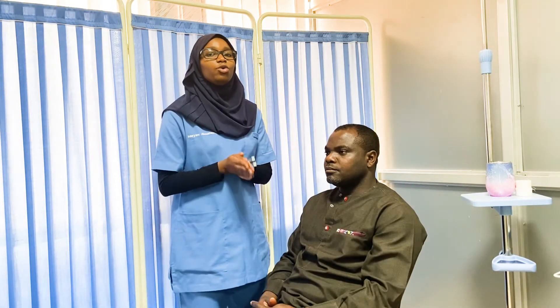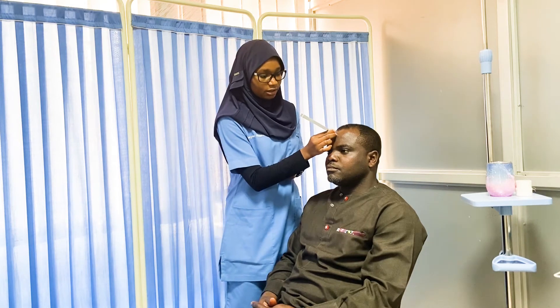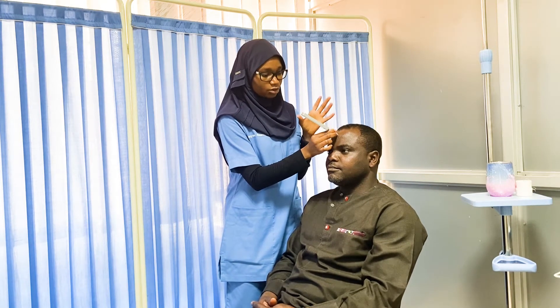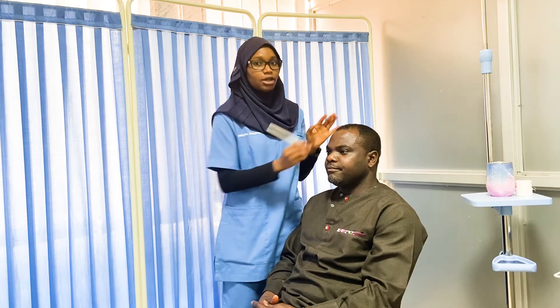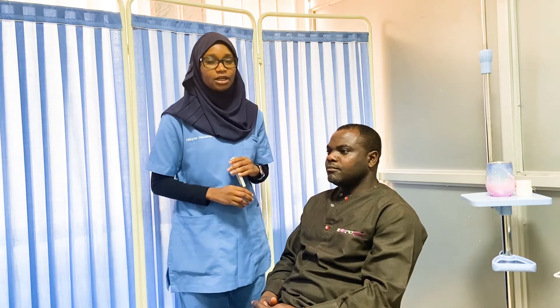Before we conclude, we need to do the Weber test. To do the Weber test, we place the tuning fork on the patient's head and ask: is the sound the same on both ears or different? If it's the same, then this is a normal situation and we can say the patient has normal hearing.